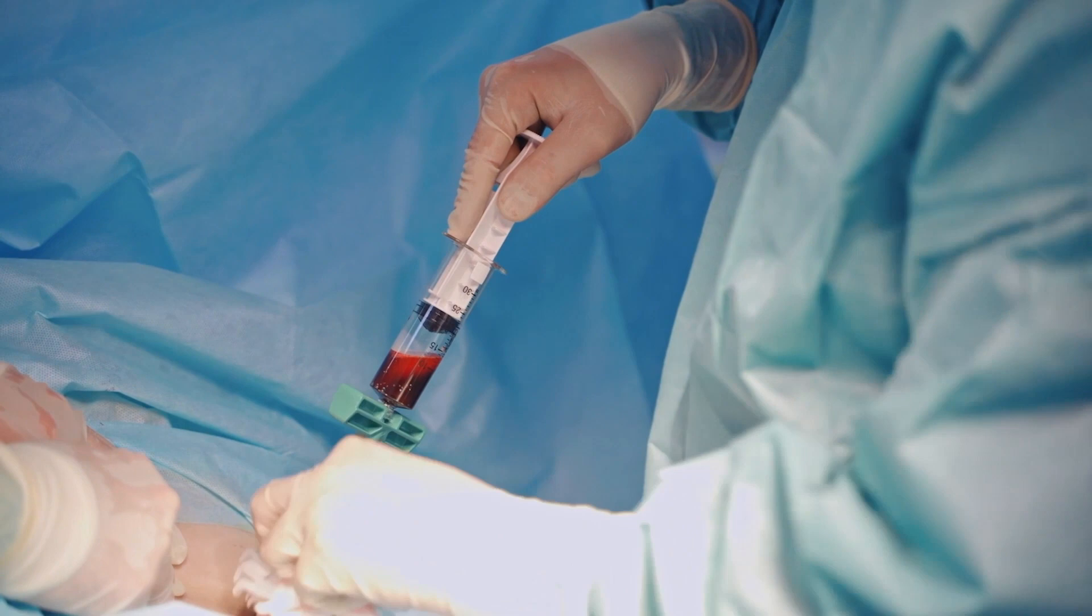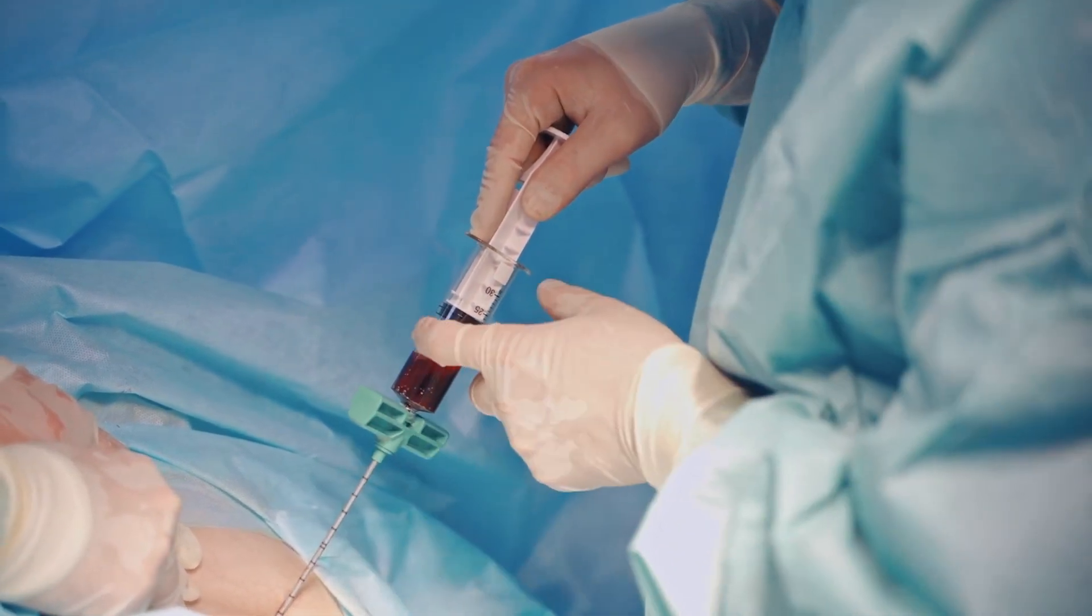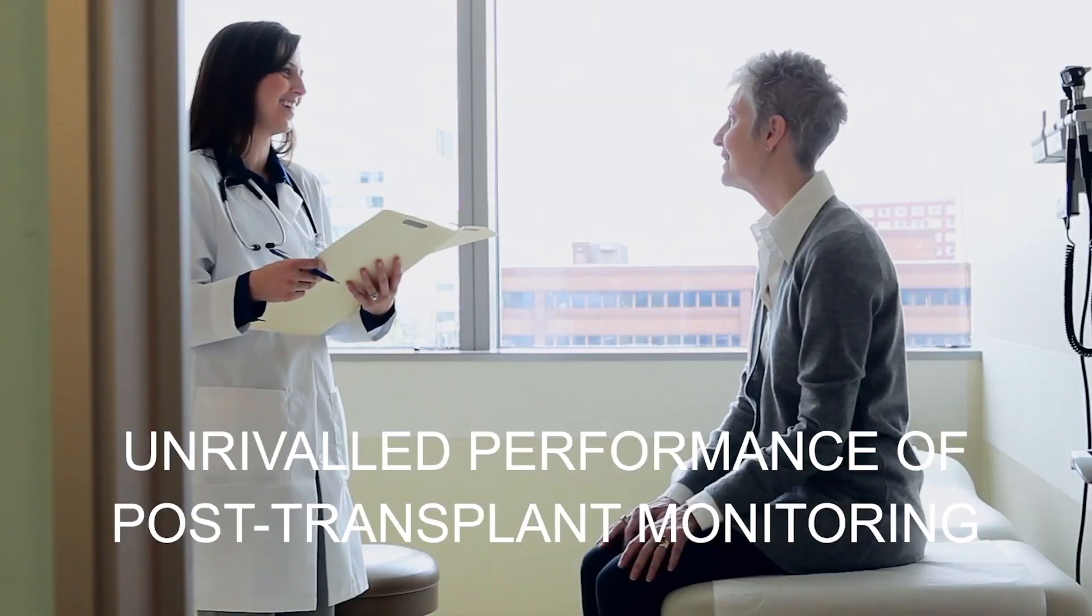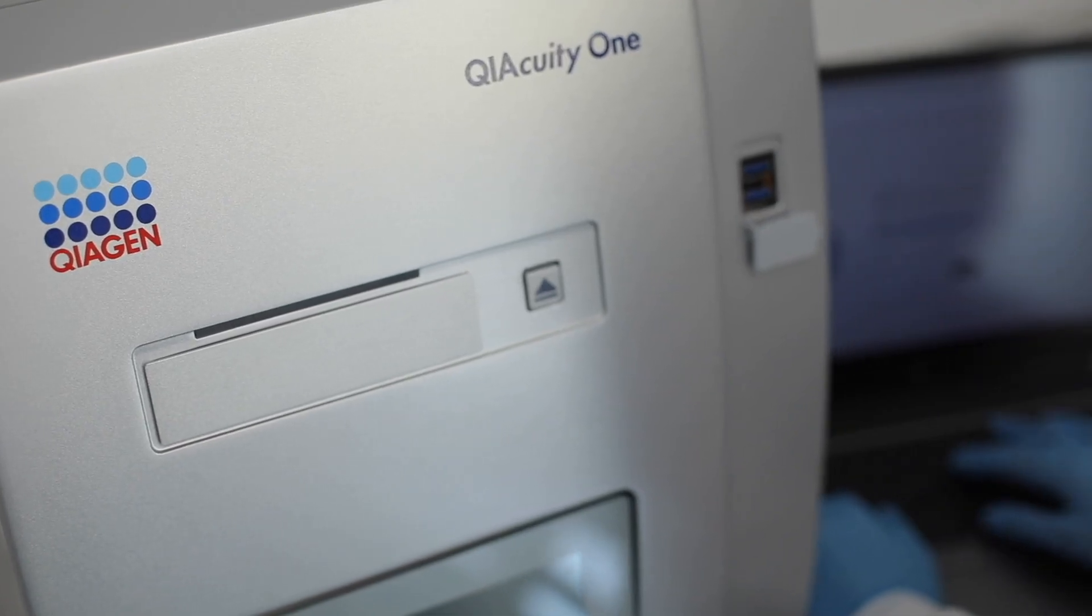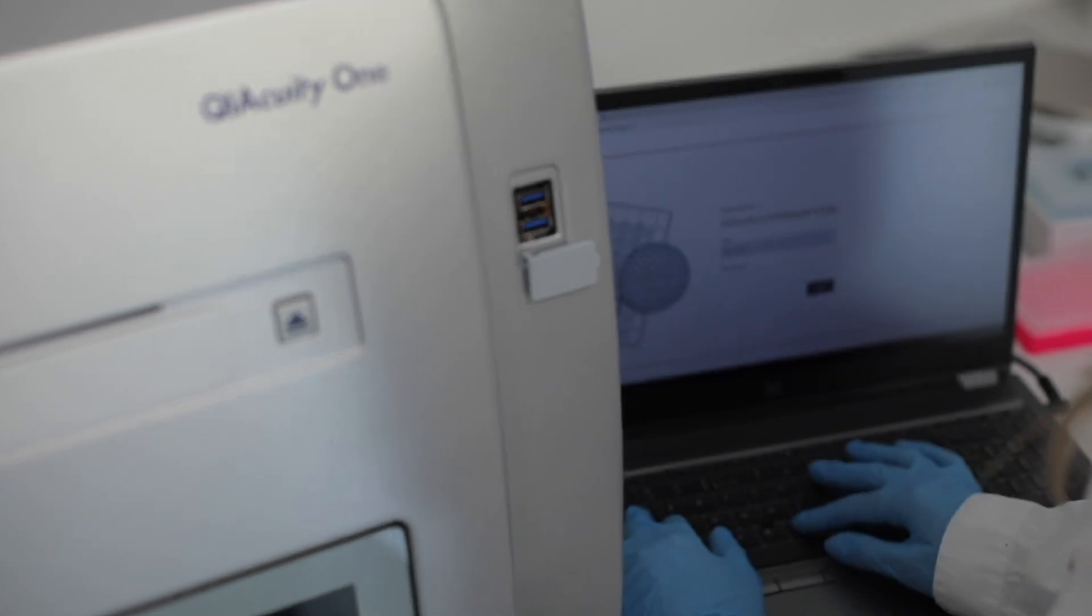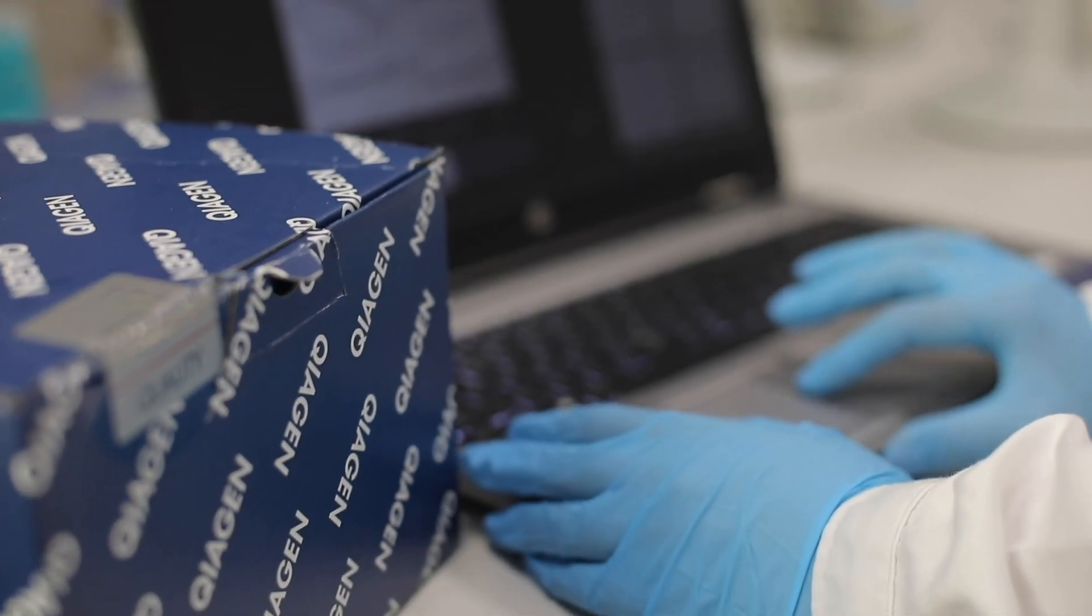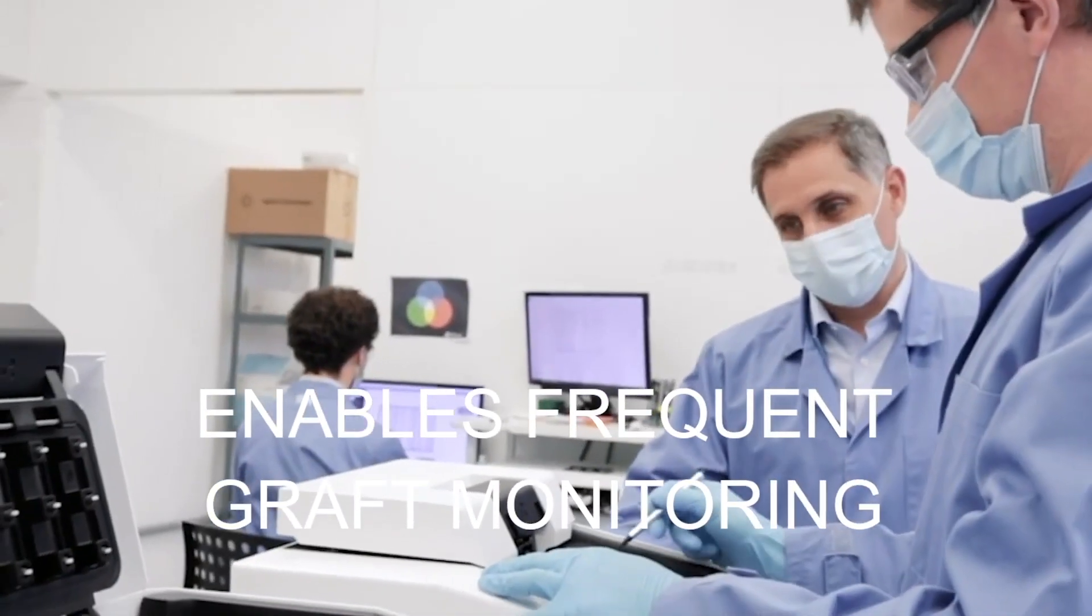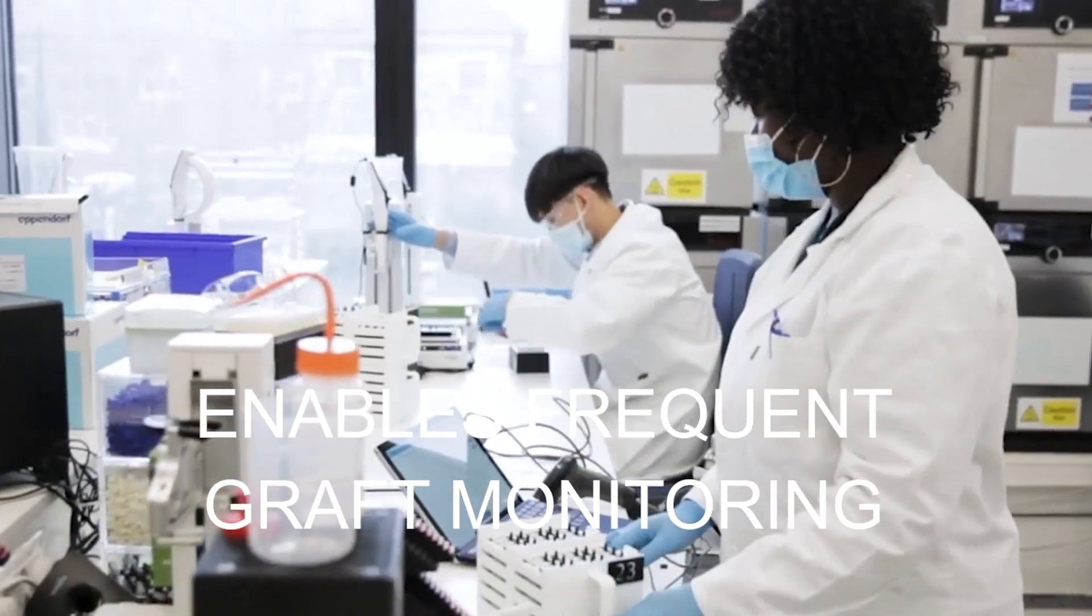Holograft makes use of advances in cell-free DNA testing to deliver unrivaled performance of post-transplant monitoring. With frequent testing, early detection will be possible by having more measurement points. Labs could measure the absolute quantity of cell-free DNA with a fast turnaround time supported by software built to assist every step from sample to clinical decision.